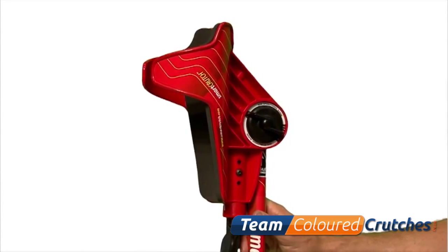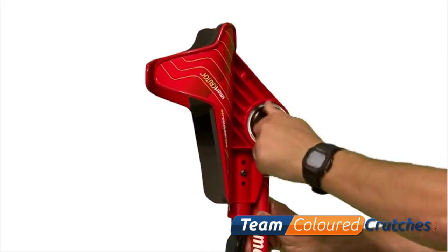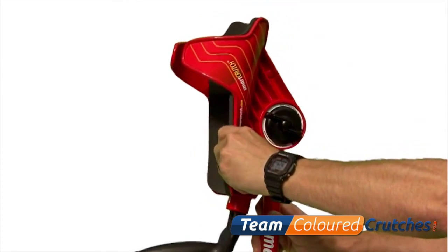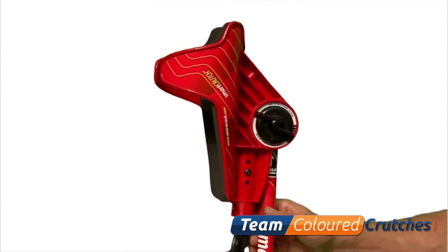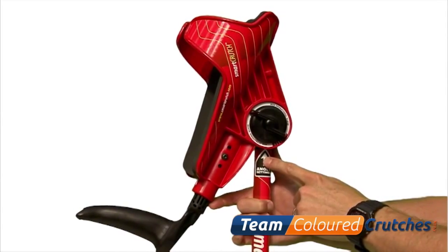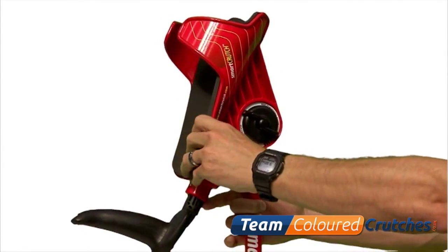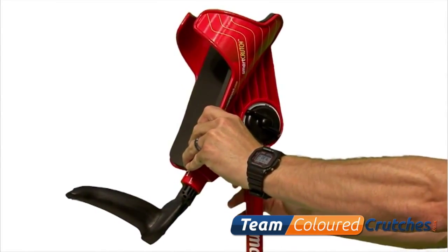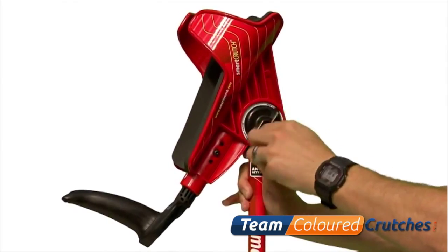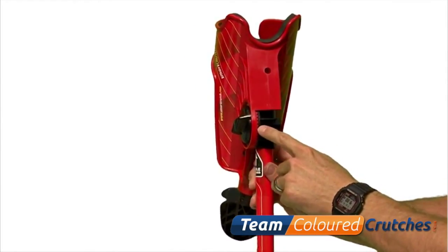The first adjustment you will make is to set your initial angle position. First, loosen the large wing nut located under the forearm platform so that the angle adjustment moves freely. There is a position selector and an arrow on each crutch, and we suggest starting with position 1 for the initial setup. Line up position 1 with the arrow and begin tightening the wing nut while ensuring that the teeth are meshed correctly by looking at the back side of the crutch.